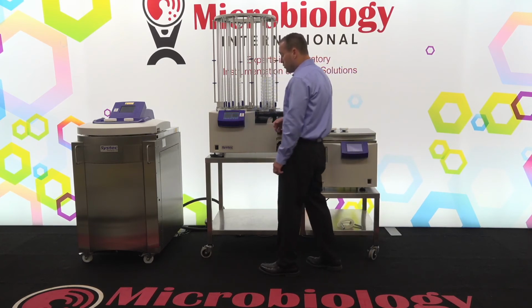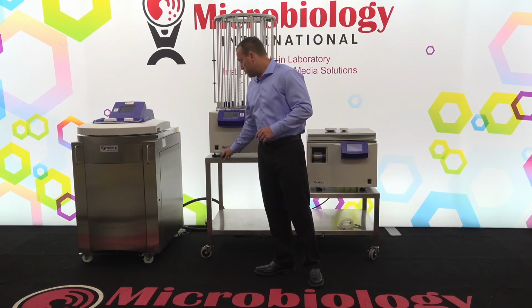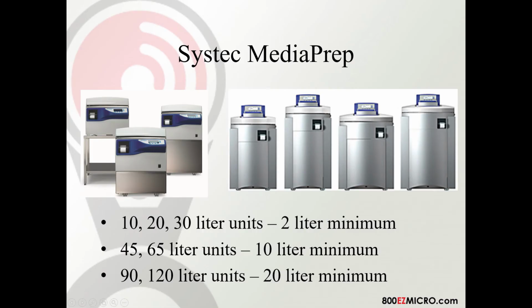So now I'm going to finish up with, again, our PowerPoint presentation, just to hit a few key points, and then we'll open it up for questions. So the Systec MediaPrep line, again, we have multiple units. So we have 7 different instruments.